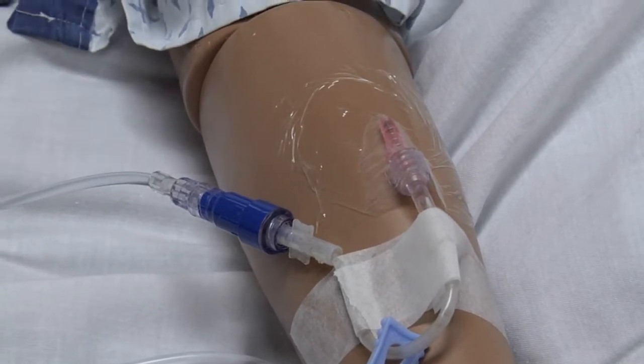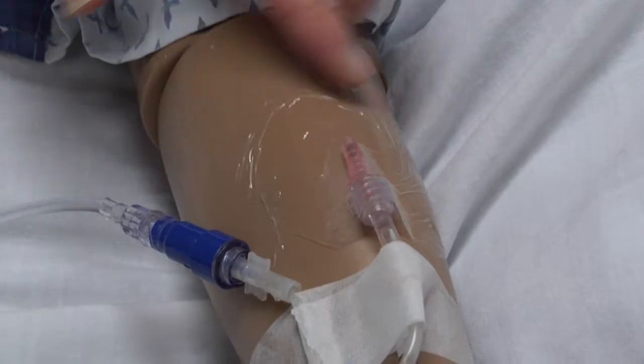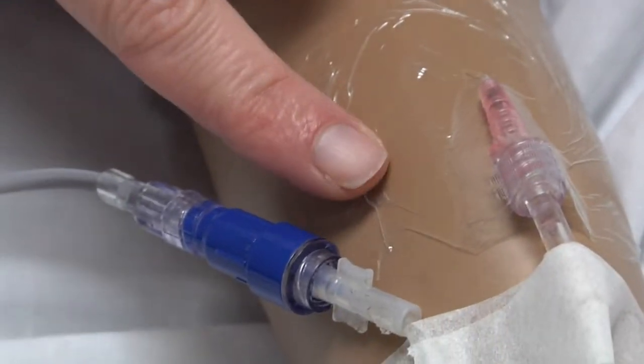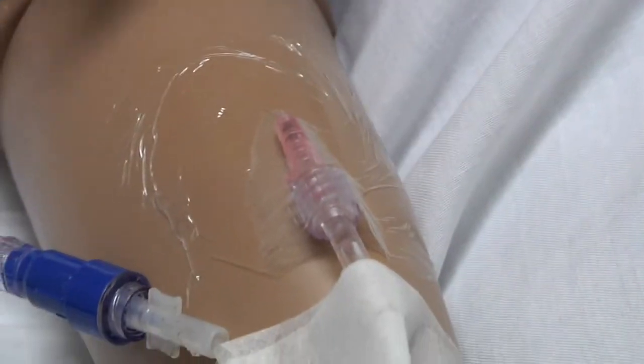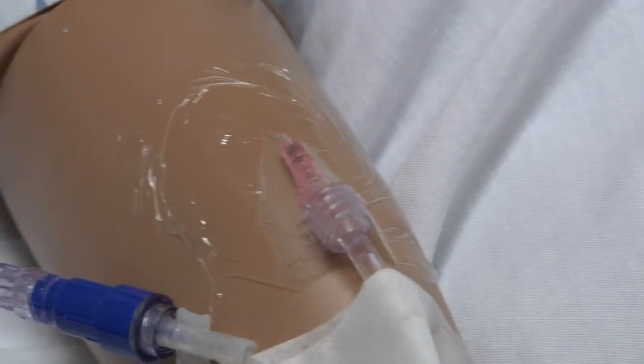The fluid is running into the subcutaneous tissue. So when I would look at this, it would be cool to the touch because the IV fluid would be cool. She would tell me that it's sore and it's tender, and it would be swollen. It would be quite edematous around that area, and it probably is not running at the right rate either.